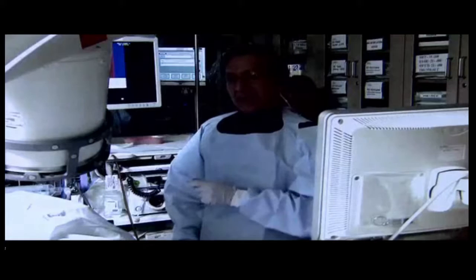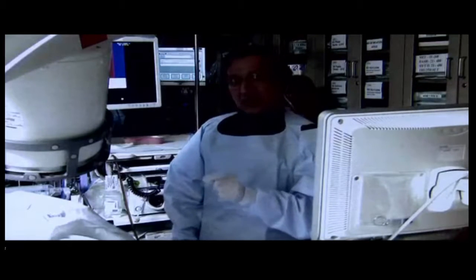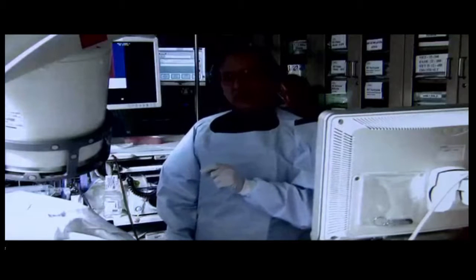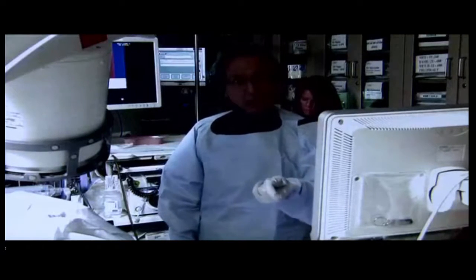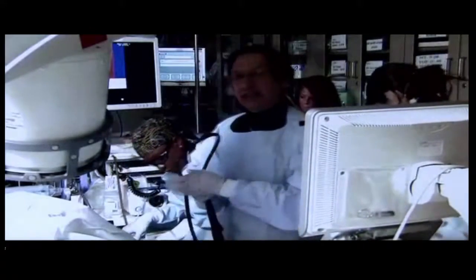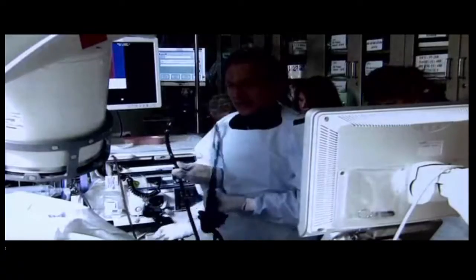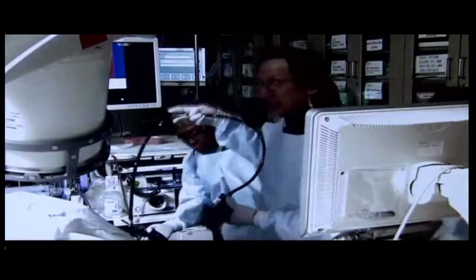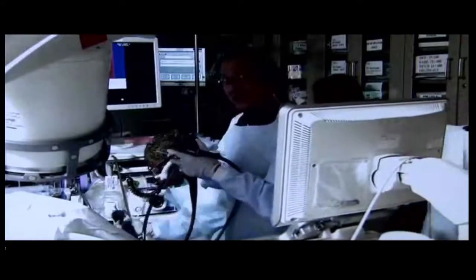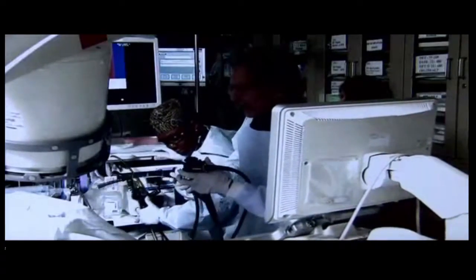millimeters. In this case, I used a 22 gauge needle. Of course, a 19 would be difficult. 22 gauge needle, and then I passed the Pathfinder wire, a .018 wire. You can use also the Roadrunner wire. So there are a number of .018 wires. There's actually a new wire that Boston is coming out with called the Navi Gold, which I hear is a very nice wire. It's very stiff. So despite the small diameter of .018, it's a very stiff wire, so you can instrument nicely over it.